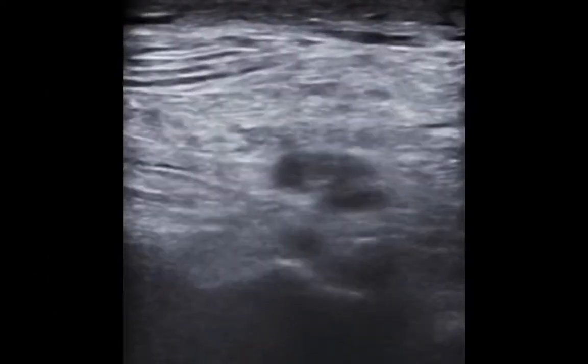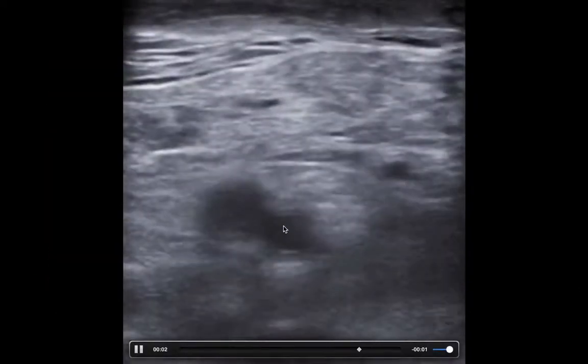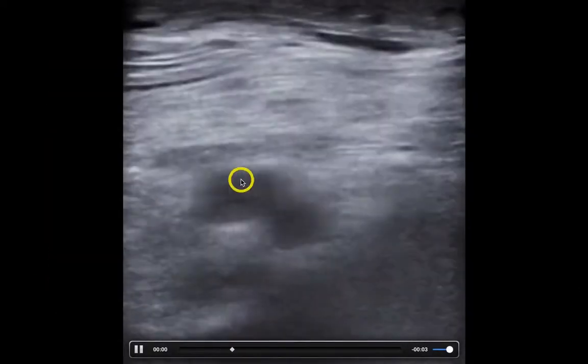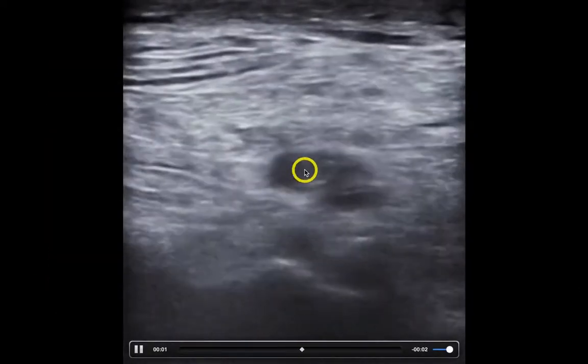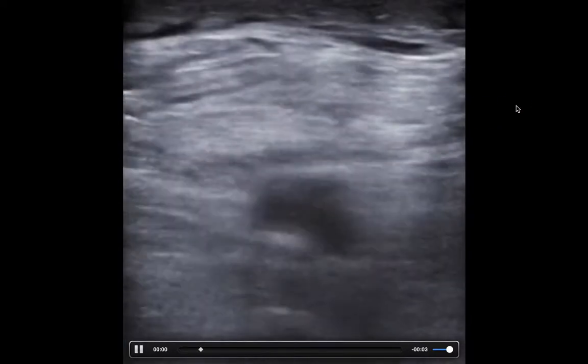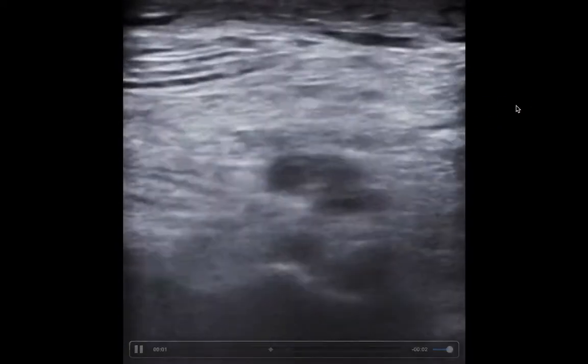This is what a popliteal clot looks like. We have the artery here, which is deeper. And then up here we have the vein — you can see there's an echogenic structure within it, and it's non-compressible.